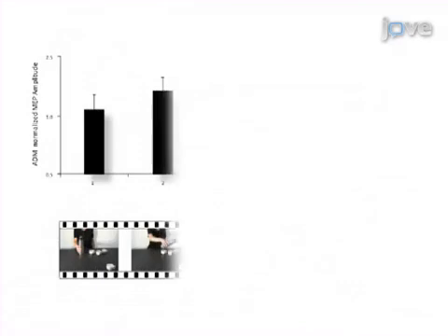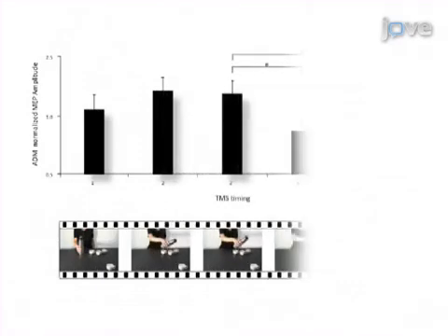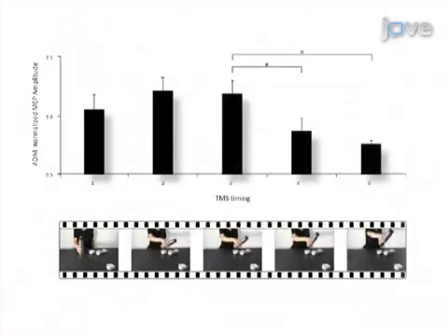Results are obtained that show an early switch from an emulative to a context-related response in corticospinal activity, based on a differential activation of the stimulated hand muscles. This method can help answer key questions pertaining to the social neuroscience field and specifically action observation.